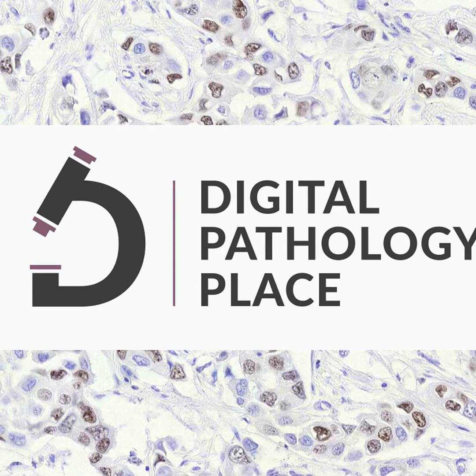So if you think about the reason why that's possible now, a lot of it has to do simply with technological development. So for example, when we first started research, you would try and go and buy a hard drive to hold the whole slide image. The size of a whole slide image has not fundamentally changed in the last 10 years. They've always been about 1 gigabyte or 2 gigabytes, whatever it is. But the cost for storing that has changed. So previously you would buy a 10 gigabyte hard drive.